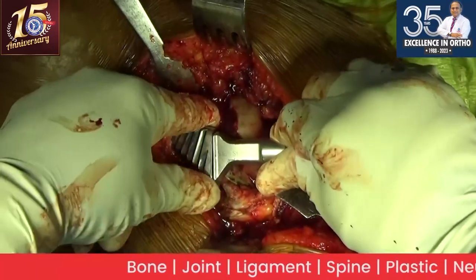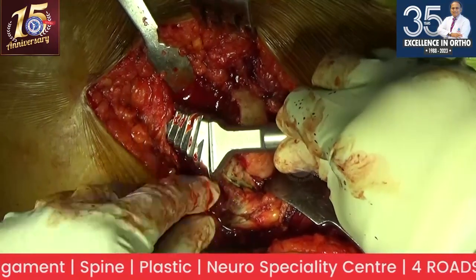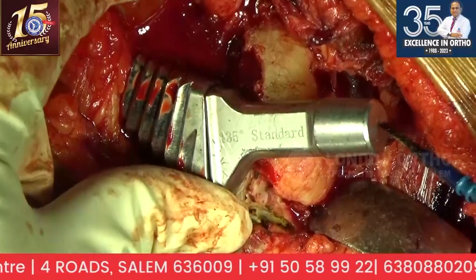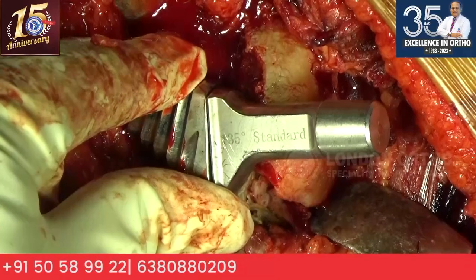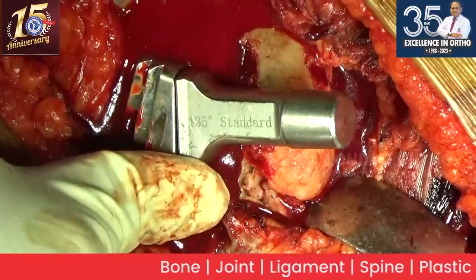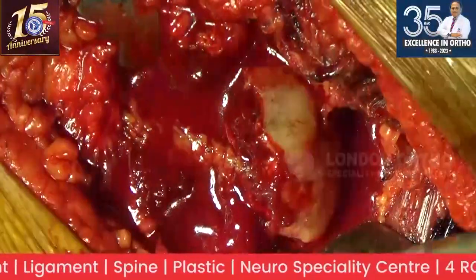Okay, so this is along the stem. This is 135 standard. So if I cut it here, the center of the head will be at this level. Okay, that is nearly a centimeter above the tip of the trochanter. That's the reason I wanted to cut a bit lower. That will correspond to the tip or slightly higher. We may lengthen her a bit more than the opposite side, but we are talking about a few millimeters.